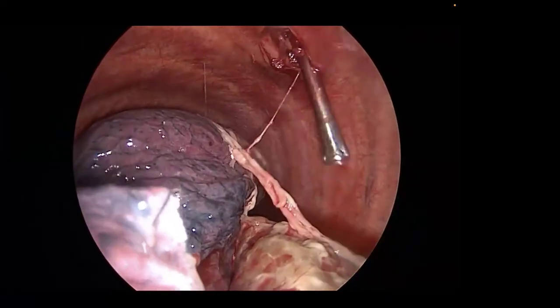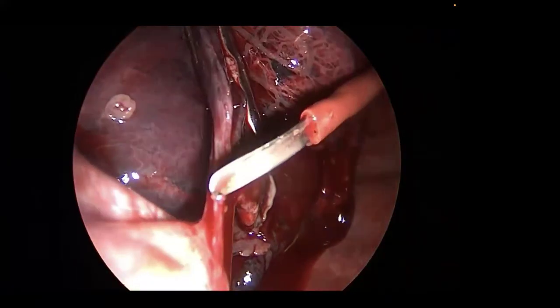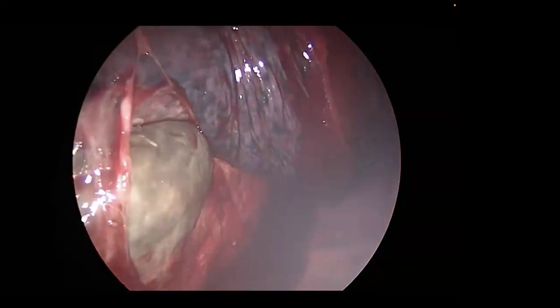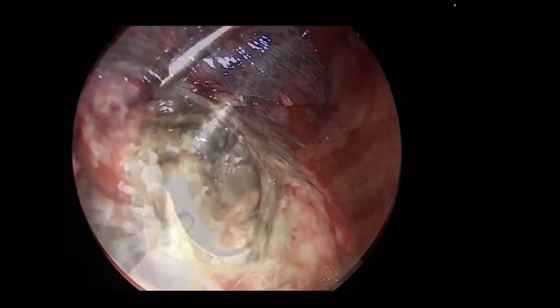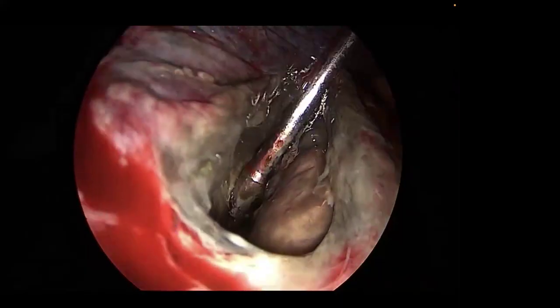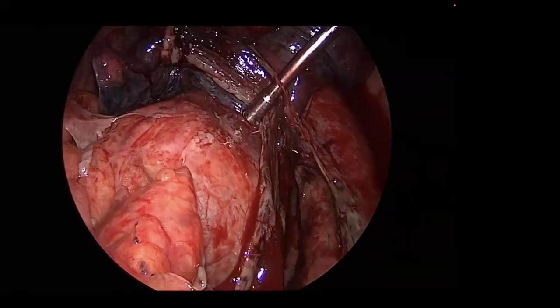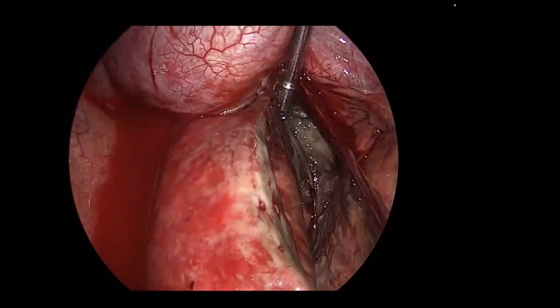We first do it by minimally invasive means. This patient came to us and we sent this patient for an endoscopy and stenting first to control the leak from the esophagus. There was a large rent at the lower end of the esophagus, which was controlled by the stent. Then the patient was shifted to the OT to address the mediastinum. This mediastinal collection was drained and debrided. The patient did very well and was discharged after 7 days, and the stent was removed after 6 weeks.